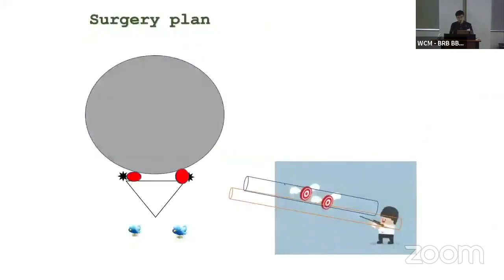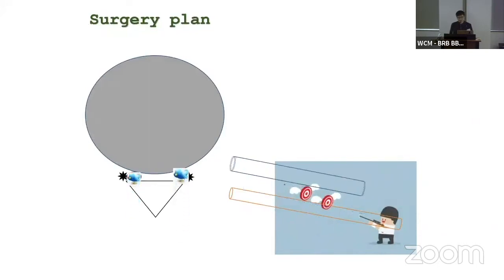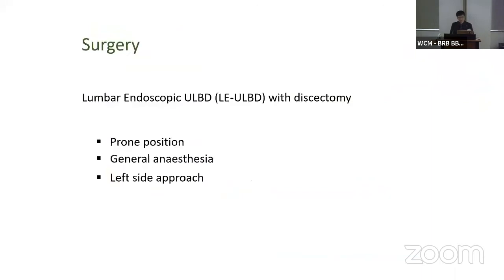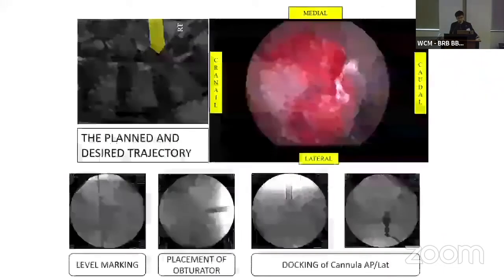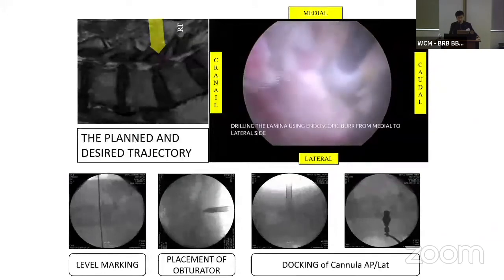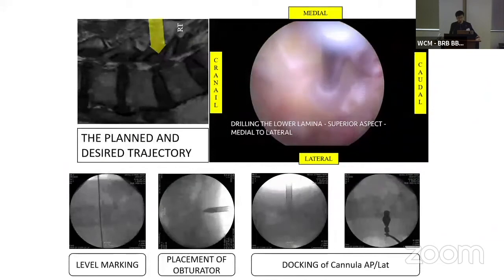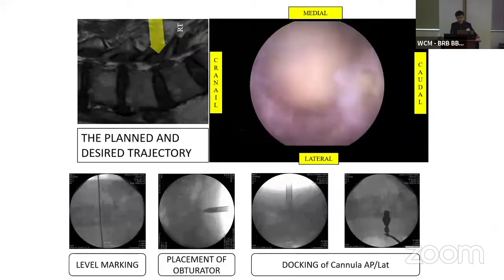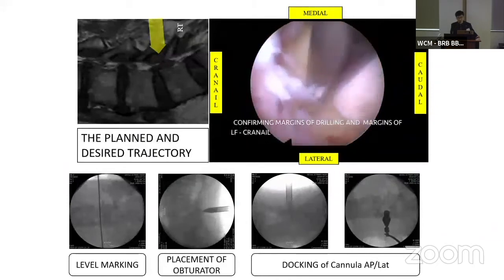This is the surgical plan. There are three kinds of problems: central stenosis and bilateral migrated disc herniation. I performed lumbar endoscopic ULBD with discectomy — prone position, general anesthesia, left-side approach. The first thing we have to do is ideal planning and desired trajectory: draw a line along the midline, mid-pedicle, and end plate on the lateral fluoroscopic image. Then we start drilling from the ipsilateral cranial side and move to the caudal side.